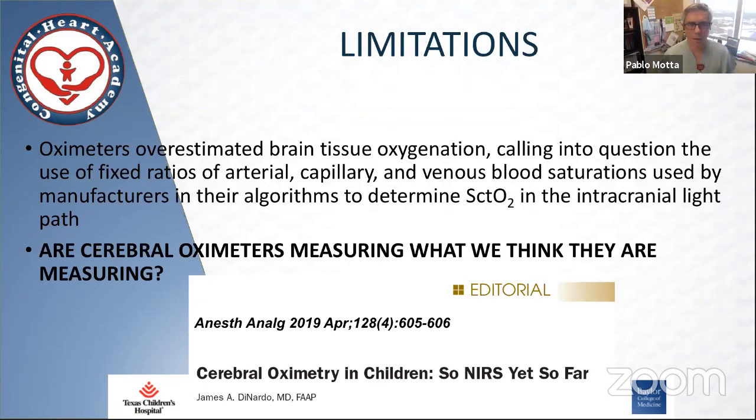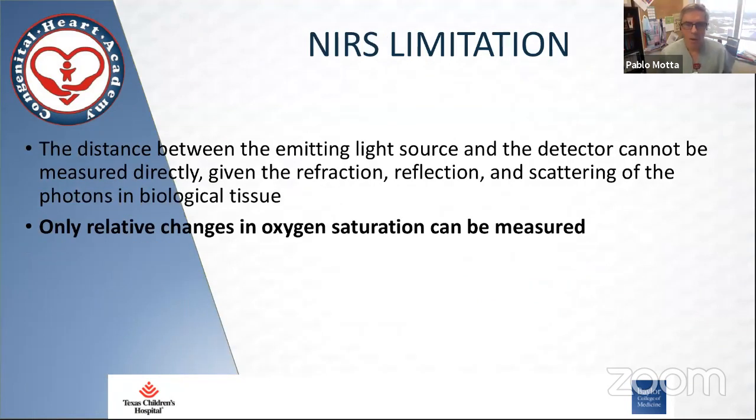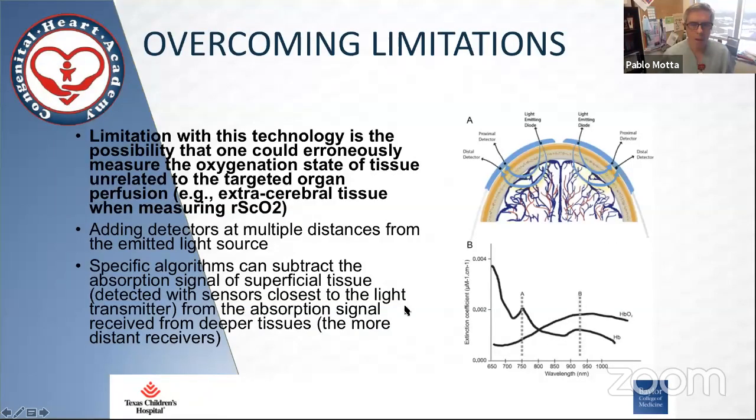There are different algorithms in the correction. So essentially, we follow this as a trend through the procedures and see the effects of the interventions we do. The important thing here is to try to get all the noise, all the artifacts, and subtract that to give us a reliable number on the regional cerebral perfusion. That's what we are interested in.